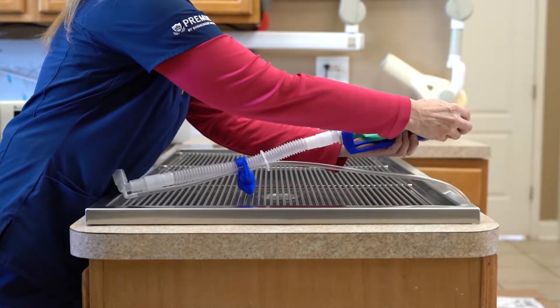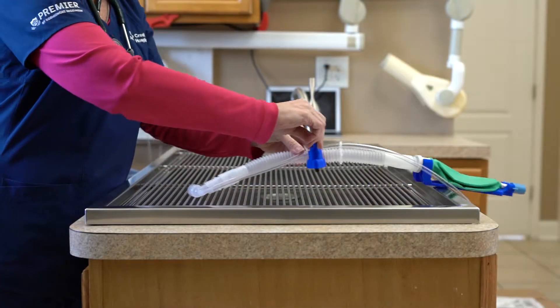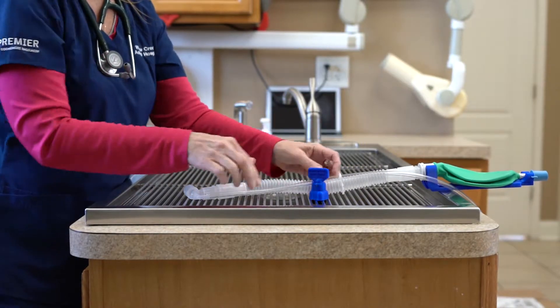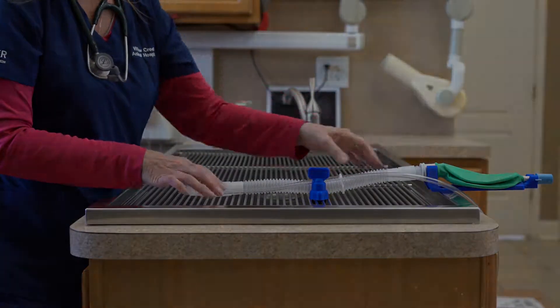Schaller Industries has replaced bandage tape with a device that anchors the hose assembly directly to the table. Optimal placement for the patient is now possible in seconds. Not only does this device easily move, it also rotates on the base, further reducing strain on the endotracheal tube.